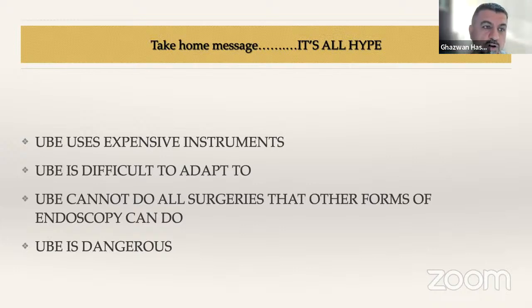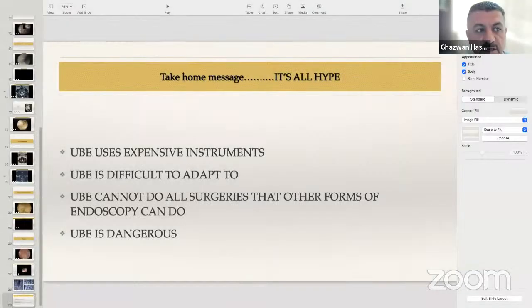Yeah, I agree with the notes mentioned. I'm doing now uniportal, biportal, interlaminar, transforaminal, UBE. As I mentioned, there are some points concerning the learning curve. For me, interlaminar is much easier than UBE, but like Professor Malcolm said, when we are talking financially, UBE is much cheaper compared to uniportal. You can do the surgery with open instruments, so for me, it's a huge impact. This year, all the cases with stenosis, I did with UBE because it's much easier. And I don't need sophisticated instruments from the endoscopic companies, which cost lots in my country. So, to summarize.